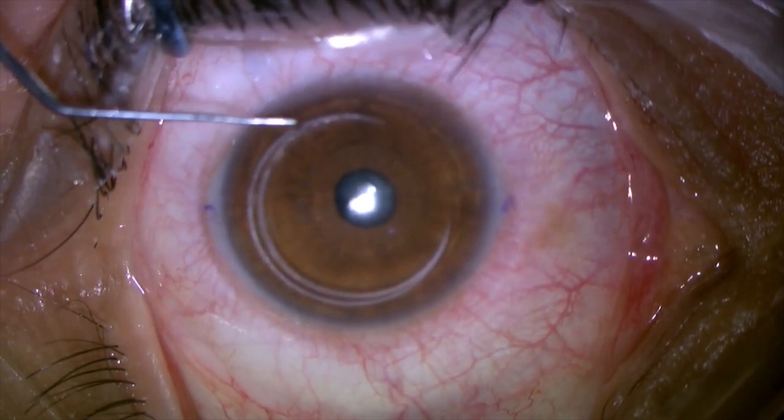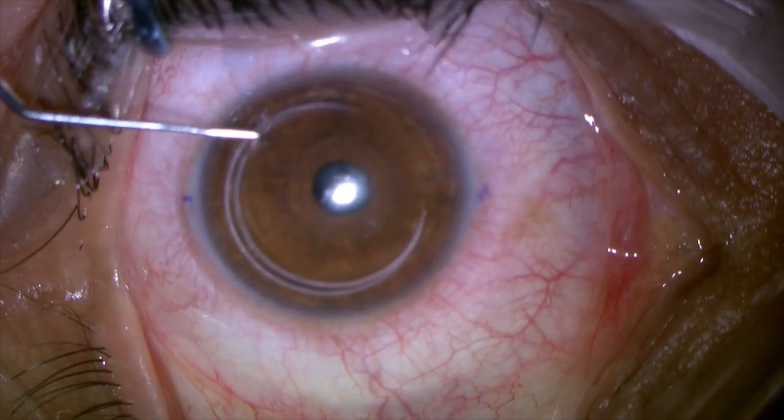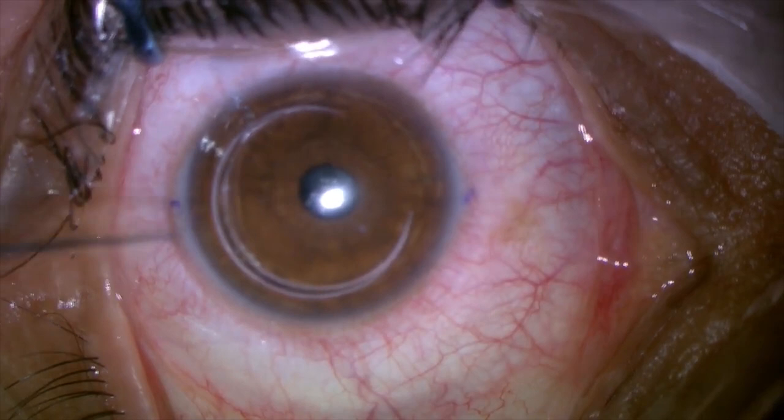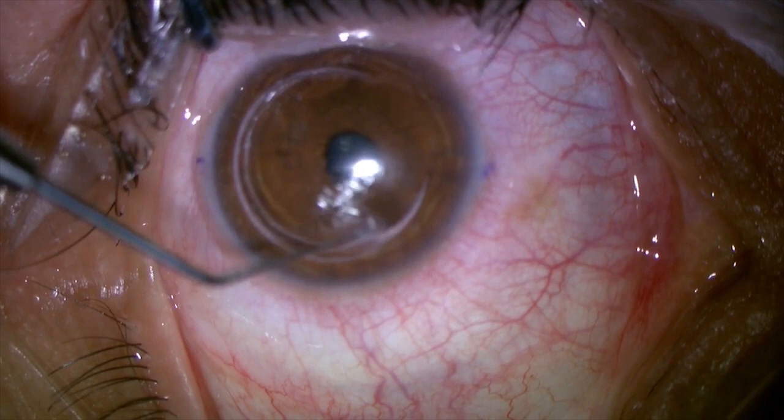So as you can see, it is completely open. There are no tags or anything. And we see it on basically both sides. So the resection is perfectly performed. We have our marks that we made prior to the procedure. Hand me the bigger one. And I'm going to basically open over here.